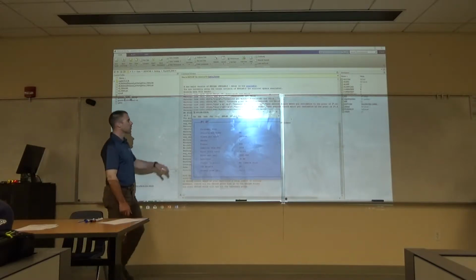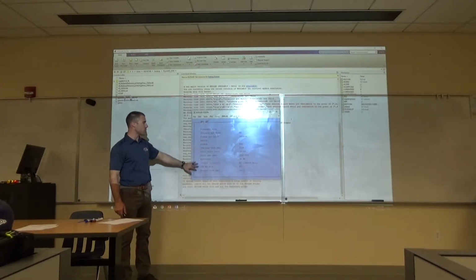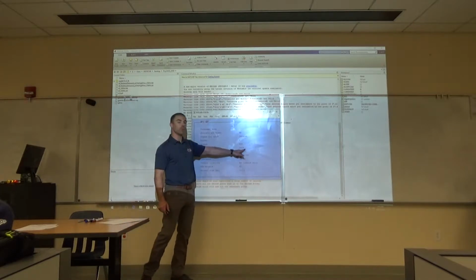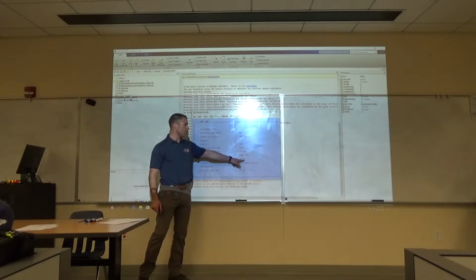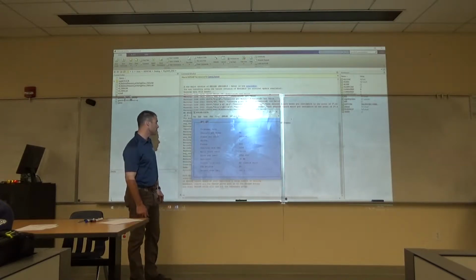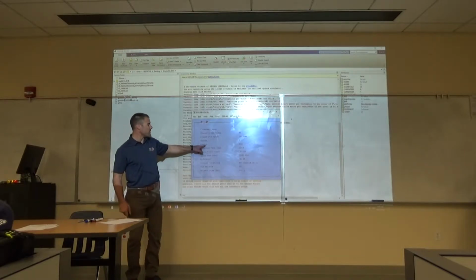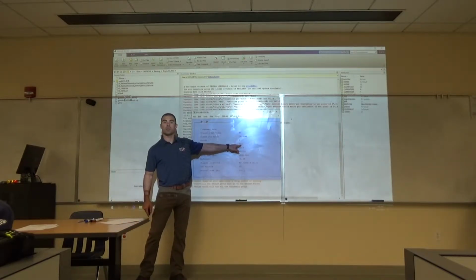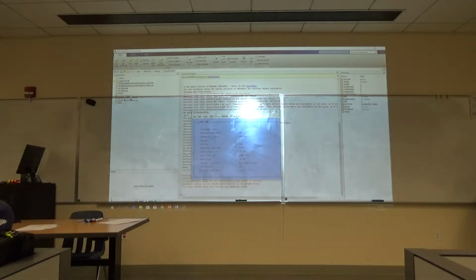It seems to work. Let's say our first data set is named number 41. Now it gives us a bunch of information here. Our sampling rate was at 1024 hertz. Our reference is the left mastoid and the right mastoid, abbreviated LM and RM. It's a good place to start. There's 900 events in the data, and we're going to see how some of those parameters change as we start to work with the data.